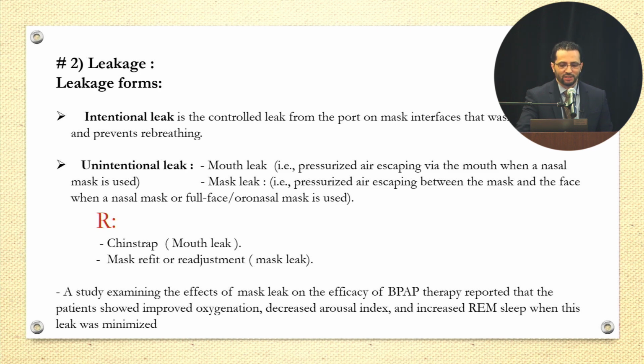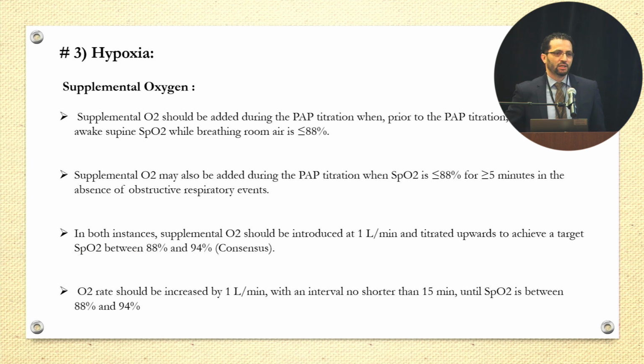And there's some data that if you improve the mask leak, the oxygenation will improve and the arousal index will be better, and also there is an increase in the REM sleep in those patients. And you need REM sleep to achieve the optimal titration.